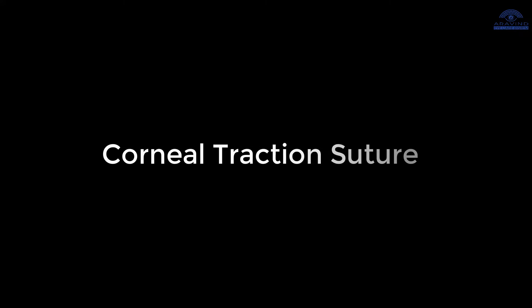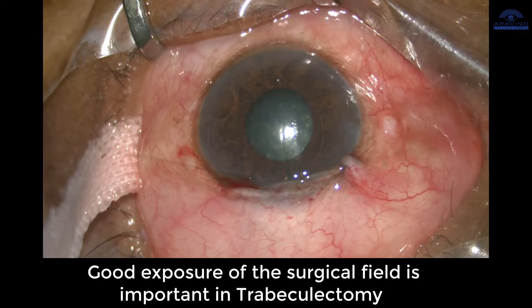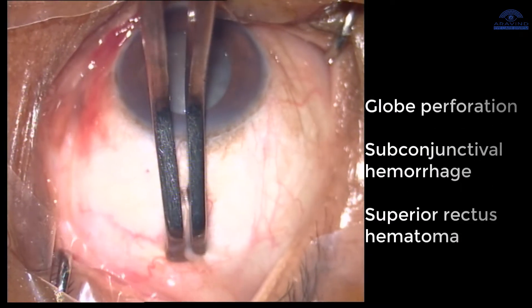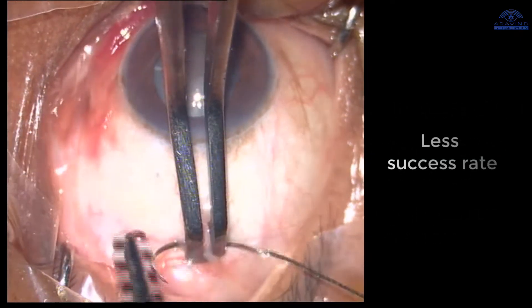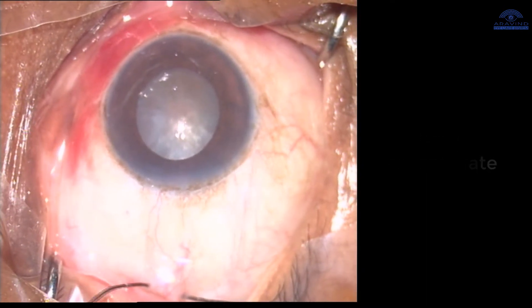Good exposure of the surgical field is very important in trabeculectomy procedures. The routinely used superior rectus suture may cause globe perforation, subconjunctival hemorrhage, and superior rectus hematoma, which may lead to bleb failure and a reduced success rate in trabeculectomy. How can we overcome this?